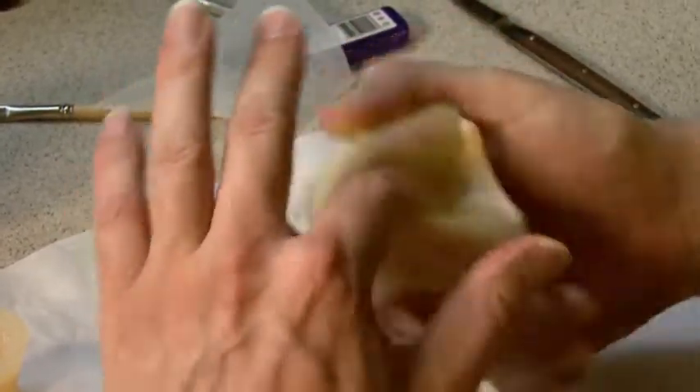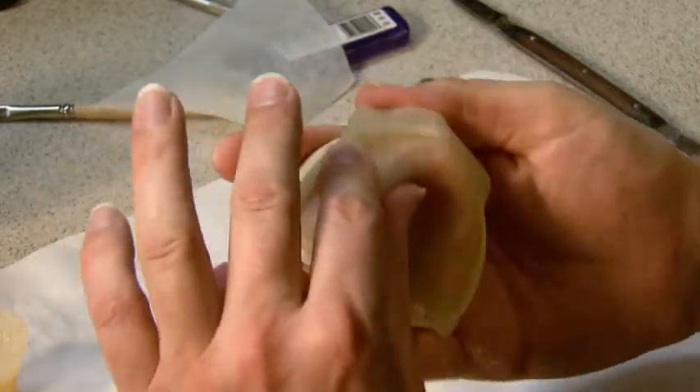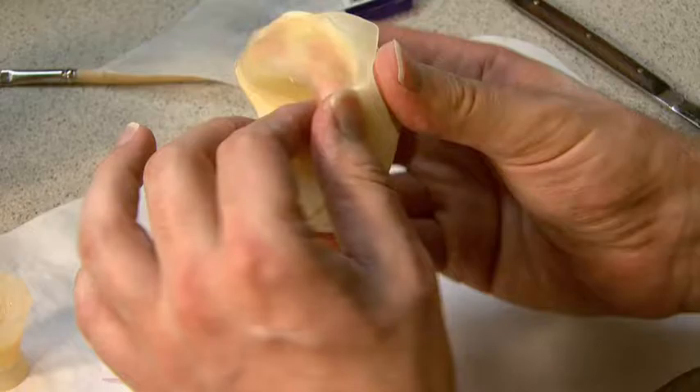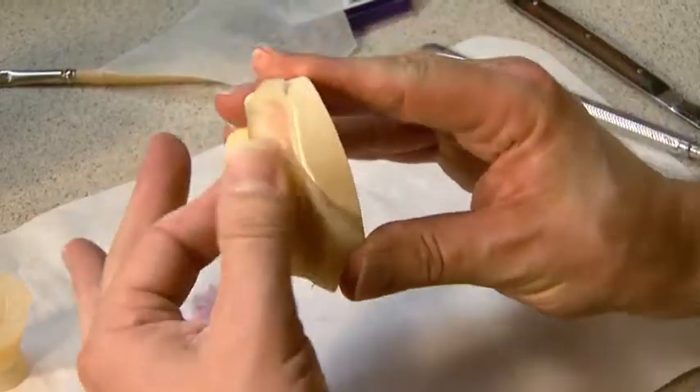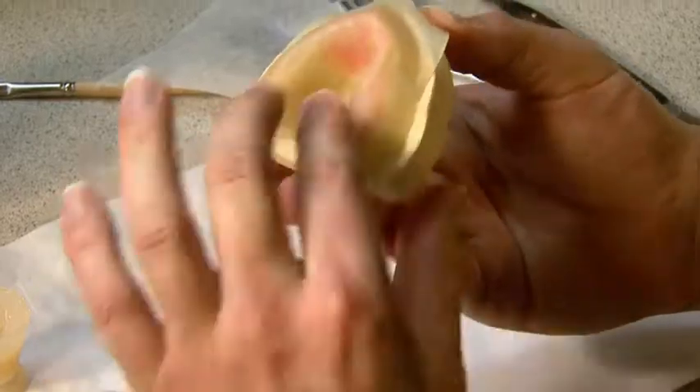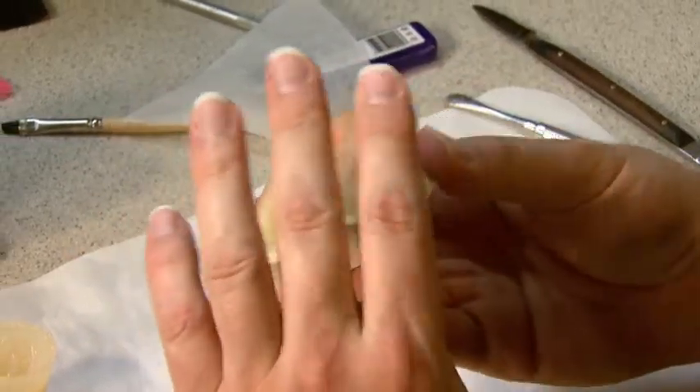So don't be afraid to squash it down there. As long as you're comfortable and confident with your wax block out, you should be okay. Again, if you're not comfortable working on the master cast, the master cast can be duplicated and the tray can be fabricated from the duplicate model — and that's a great technique too.